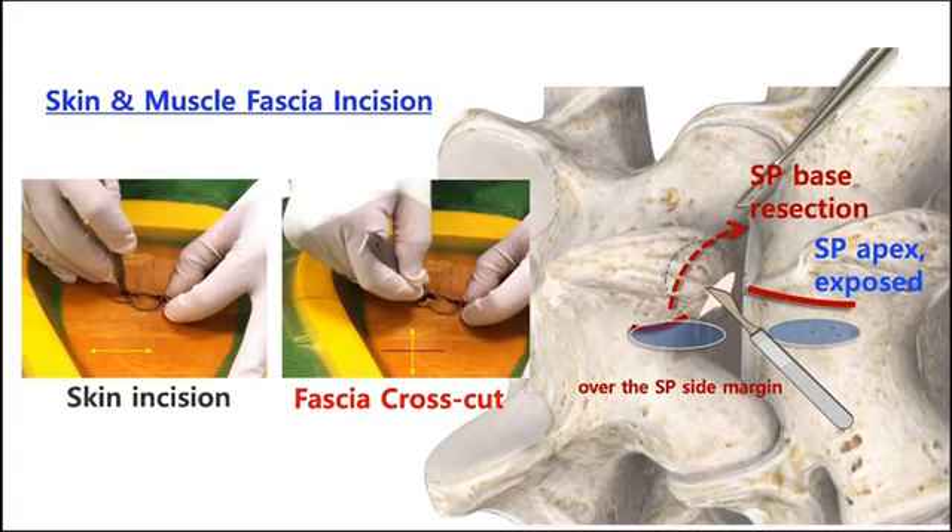Then the SP base lateral margin is exposed well, and you can start to resect the lateral and distal margin of the SP base in smooth steps.